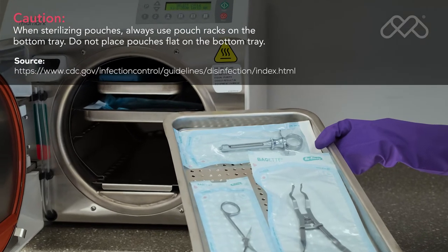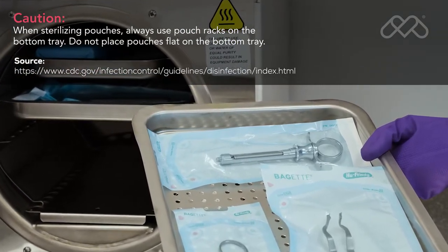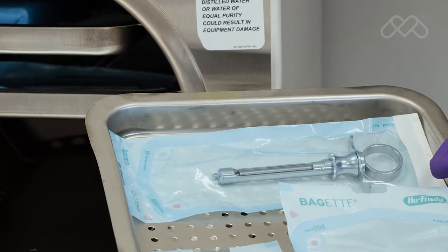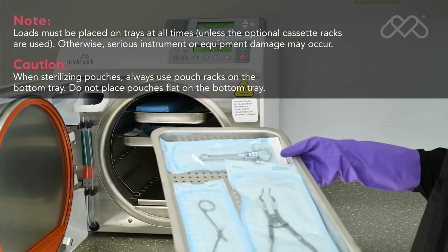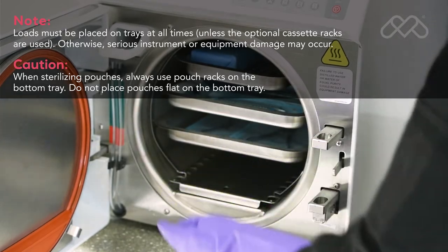According to the CDC, items to be sterilized should be arranged to permit free circulation of the sterilizing agent, and the manufacturer's instructions for loading the sterilizer should be followed. Please note that when using an M9 or M11 steam sterilizer, loads must be placed on trays at all times, unless the optional cassette racks are used, to avoid serious instrument or equipment damage.